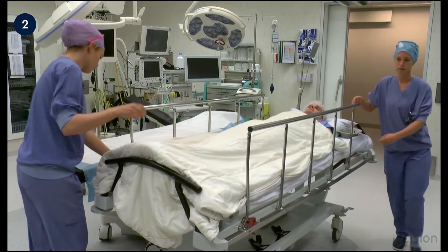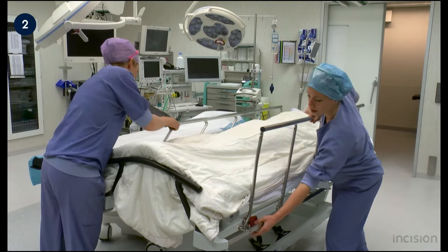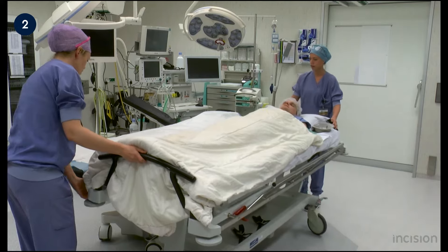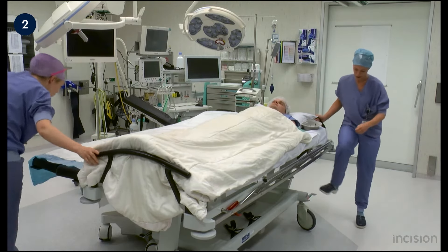The bed rails are lowered and the bed is placed right next to the operation table to enable the patient's transfer. Then it is placed on the brakes.